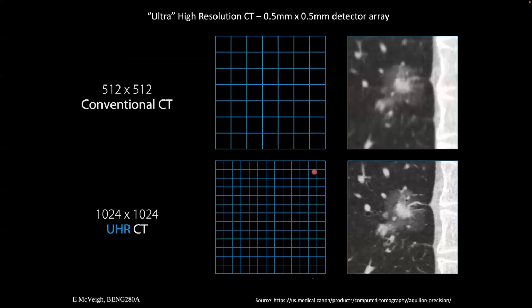And then here's an example of one manufacturer's shot at taking super high resolution pictures. And they took the standard detector that basically all manufacturers used. It wasn't the same manufacturer of the detector, but it was the same geometry. And that is, each element is separated by about 1 millimeter. And they said, well, we're going to take each element and cut it into 4 by reducing it in 2 dimensions, right? So now our new detector looks like this, right? So it's a big jump and a gutsy move for a number of reasons.